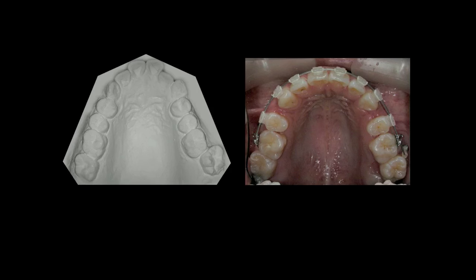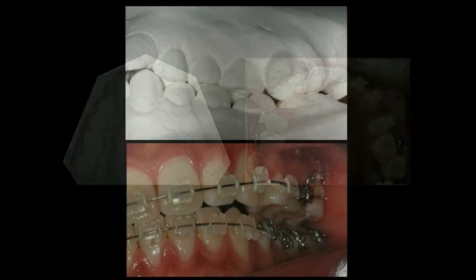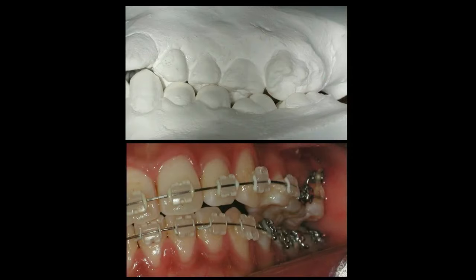After the leveling, posterior crossbite may look successfully treated. However, in lateral view, localized crossbite became generalized malocclusion due to unwanted side effect by inadvertent leveling with straight wire. Perhaps this would be more difficult to treat.